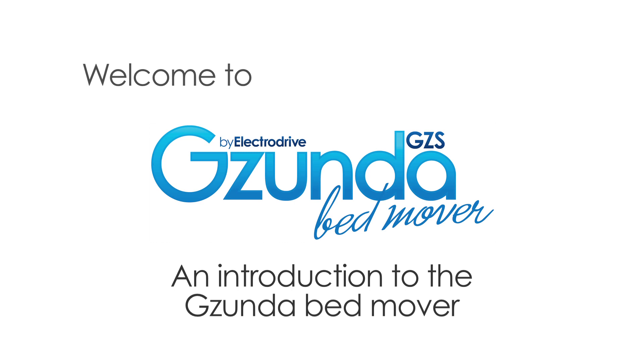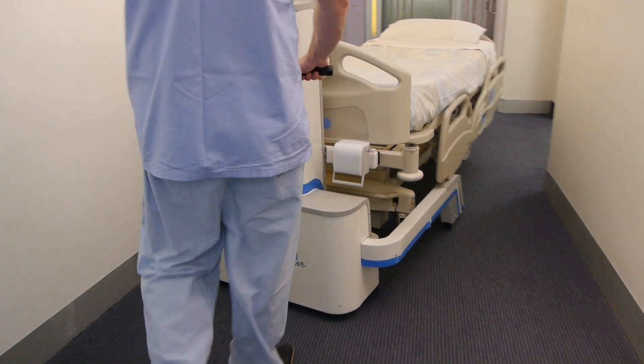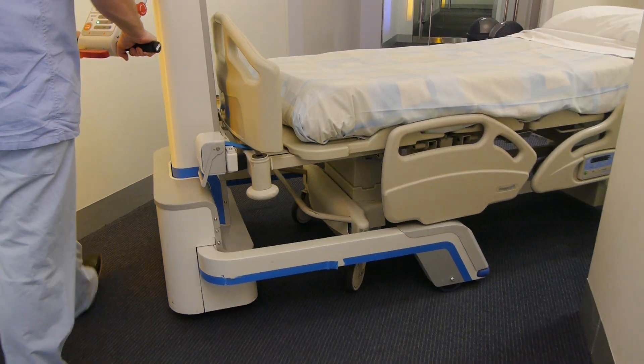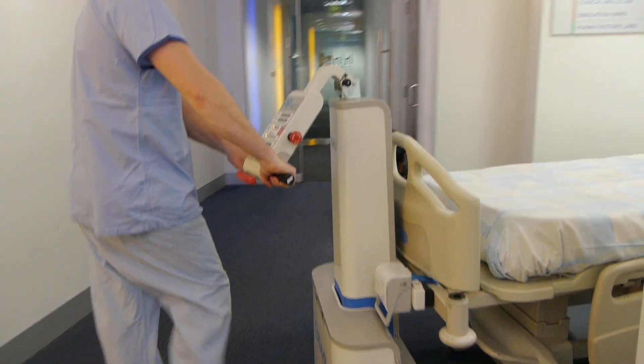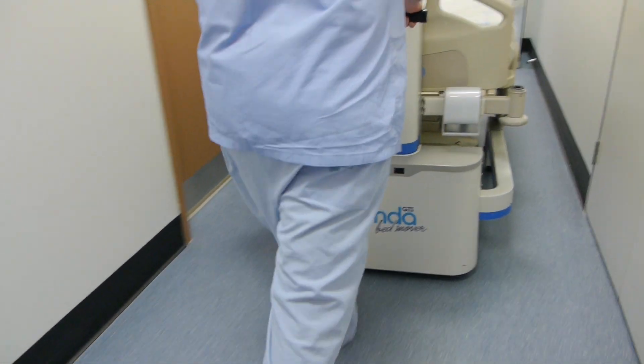Thanks for joining us for the new GZS Gzunda training video. The Gzunda is a simple machine designed to take the stress and strain out of moving heavy hospital beds, resulting in less effort and fewer injuries for you, the operator.